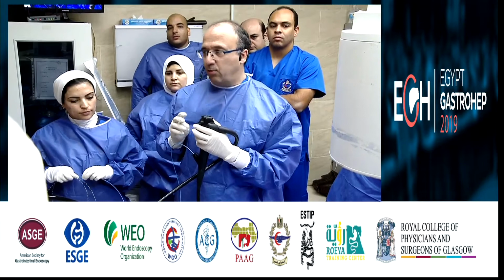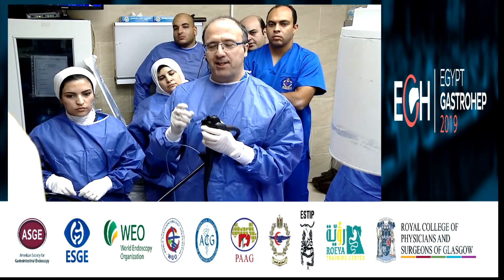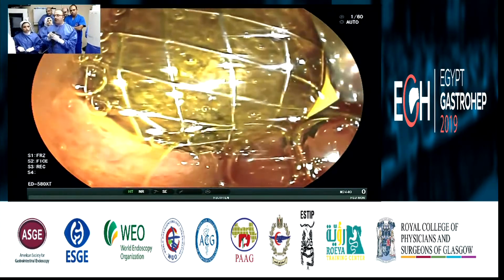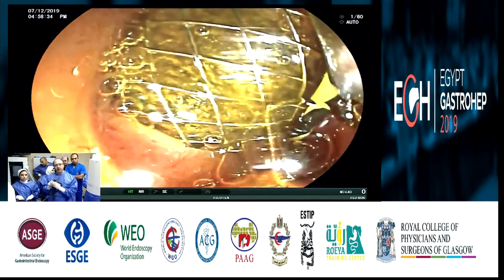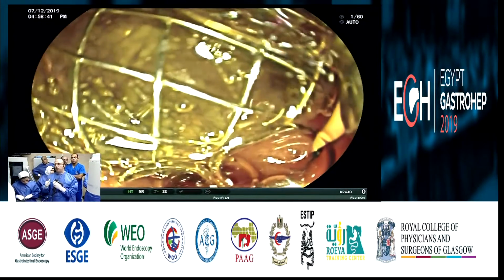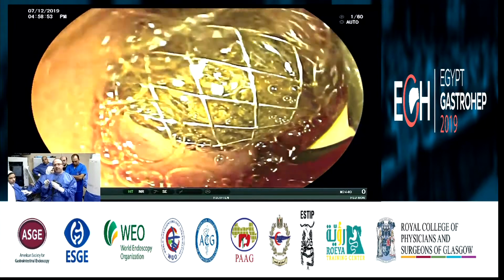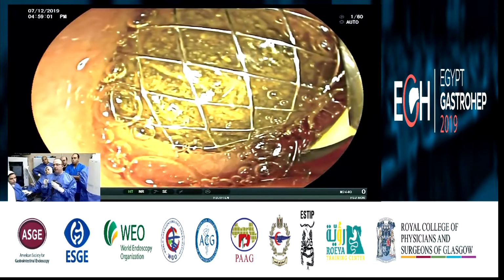Okay, so we are here with a wonderful team at the Air Force Hospital, very helpful people whose names I'm sorry I can't pronounce or remember, but I'm very thankful for what we've done so far, which is not a lot. We've only passed a guide wire through a duodenal lumen stricture. If you remember from this morning, this case is very similar to Professor Giovannini's. It's unresectable, locally advanced pancreatic cancer with both combined biliary and duodenal obstruction. However, the approach to palliation that we are taking is completely different. Instead of luminal stenting in the bile duct and in the duodenum, we are doing EUS guided transmural bypass.